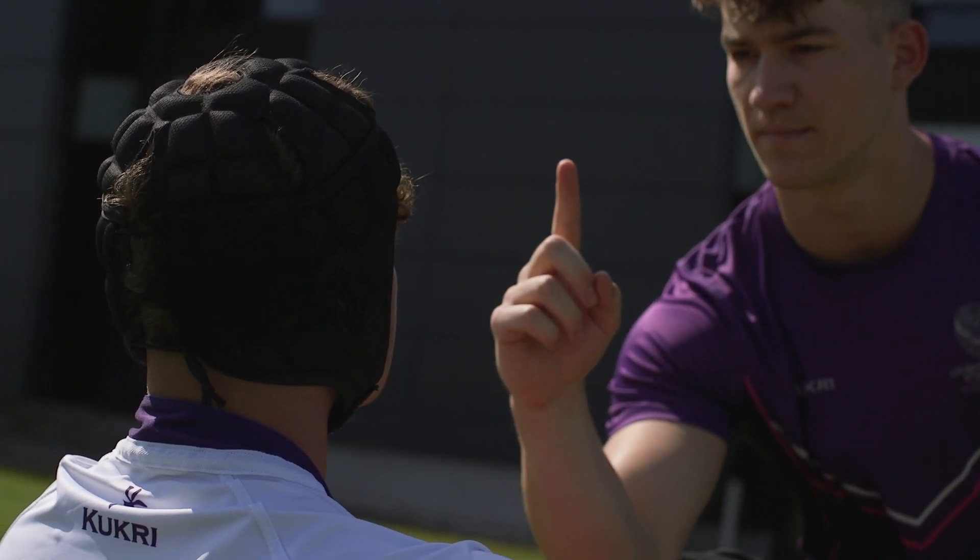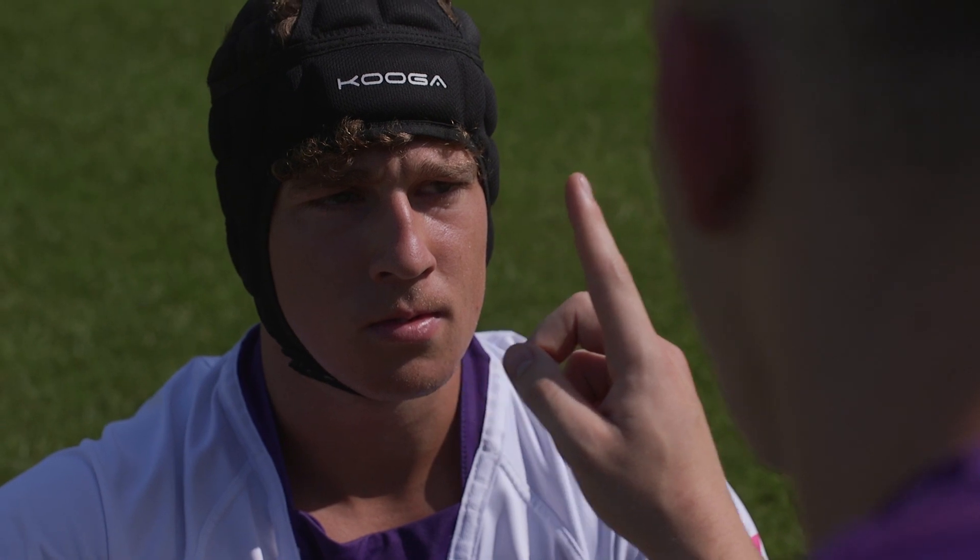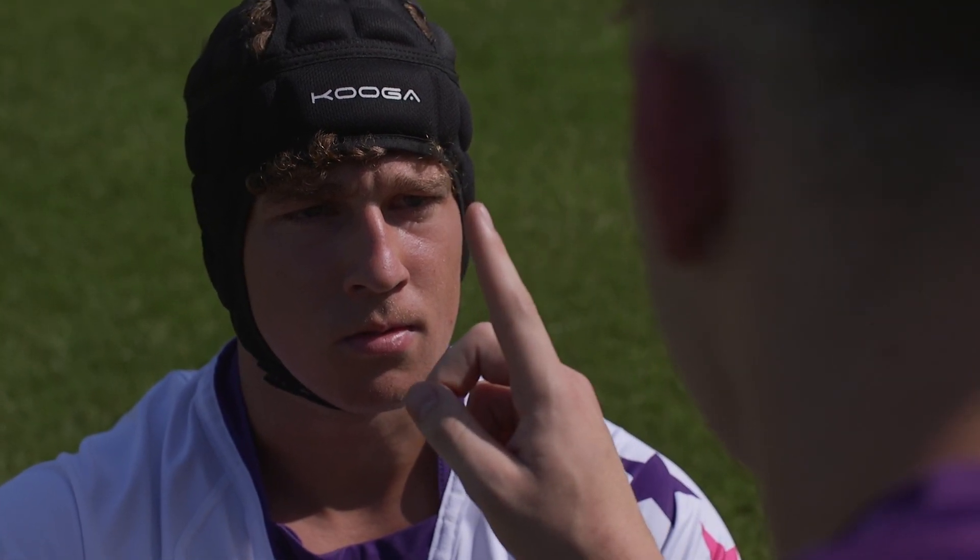Physios generally on the field use the follow-my-finger test, and results are very subjective. My product actually provides an objective result.